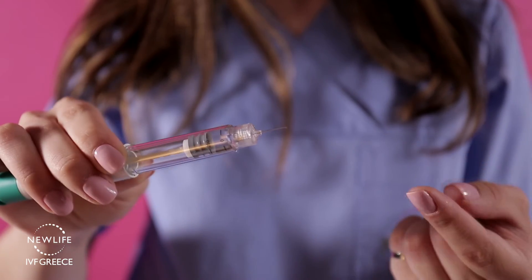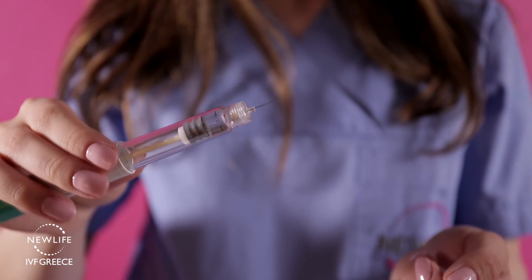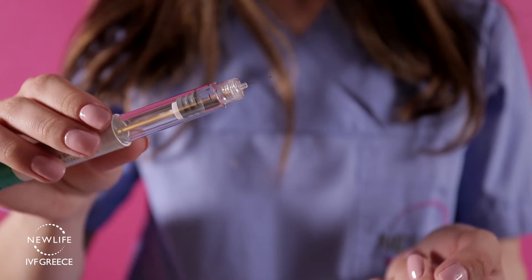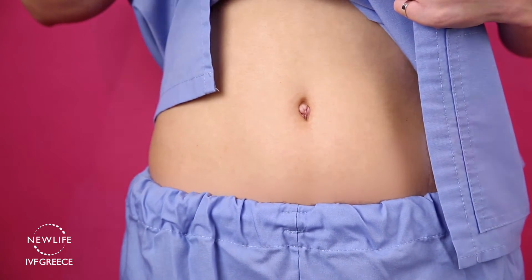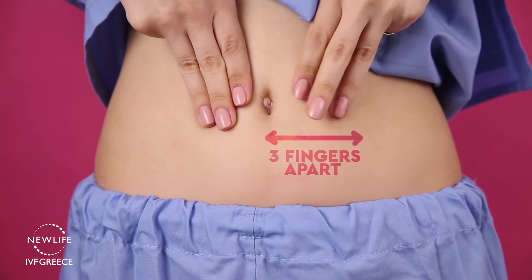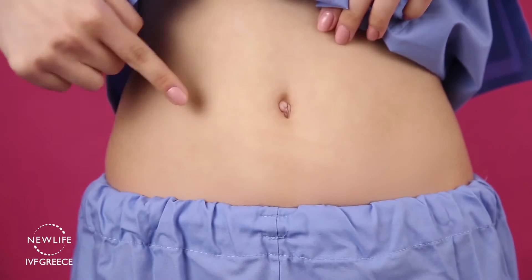This small needle is designed to deposit the medication subcutaneously, so you will need to insert the whole needle into the skin. The Ovitrol injection is a subcutaneous injection that should be performed in the lower abdomen. Use three fingers placed around or under the belly button to find the location of the injection.